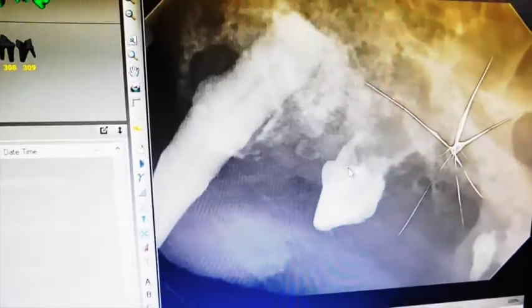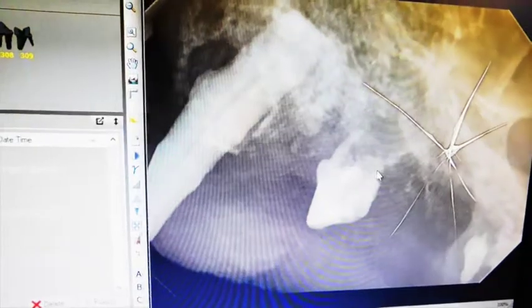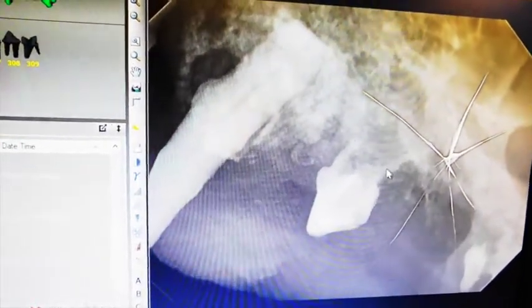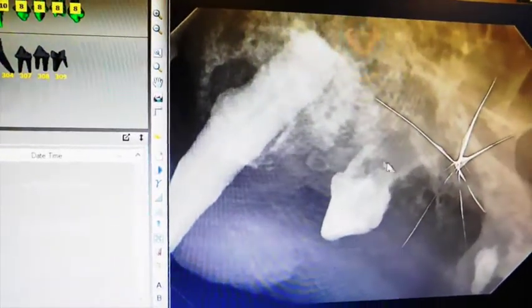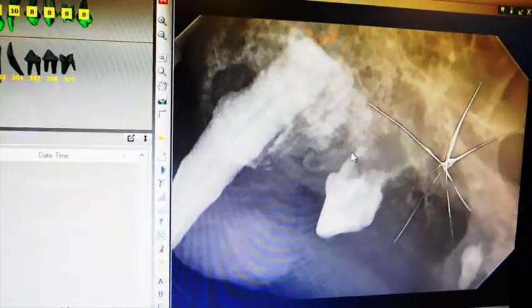Behind the canine, one is already missing, and the next one has already lost all the roots. We don't see any roots here. It's all gone, only the crown. It probably is very loose and must come out.